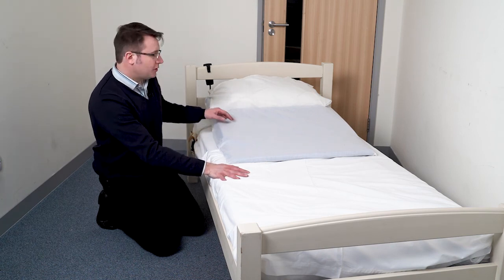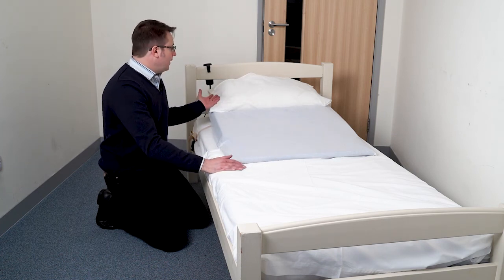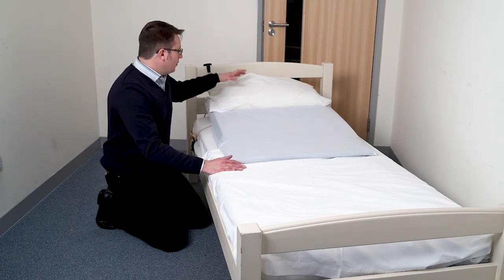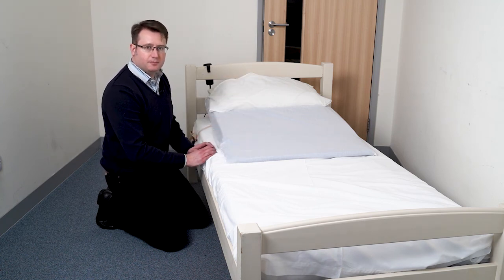You'll see in this case I've also put the pillow into the pillow pocket just to give you an idea of how it fits, and it helps as the elevator rises. The pocket will then keep the pillow captive and stop it sliding down the back.